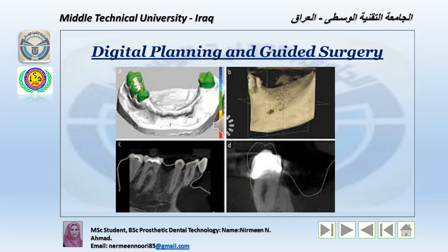Also, I will explain the digital planning and the guided surgery in this slide. The implant procedure planning should start much time before the implant placement surgery or even the choice of the implant itself. This is the concept of reverse planning.